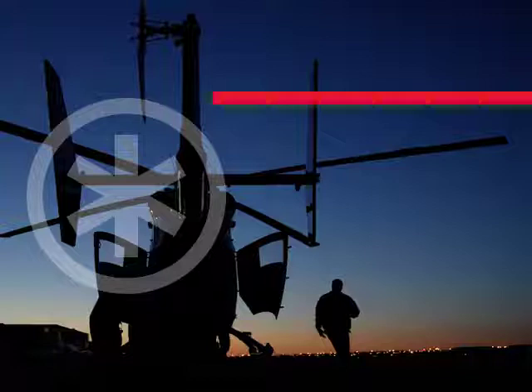So in summary, I actually just look at what the computer on the ECG machine calculates for my rate, and then I usually use the 300, 150, 100, 75, 60, 50 rule just to make sure that what the computer is calculating is about right. And that on a day-to-day basis is really how I do rate. And then if you really want to nerd out, I've given you the formulas here and the first principles to work it out if you're one of those guys who've got calipers and a ruler and want to show how smart you are.